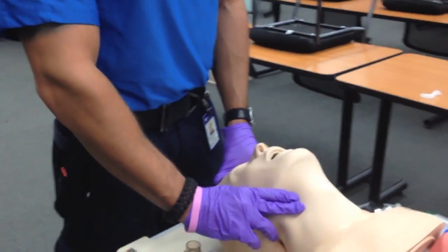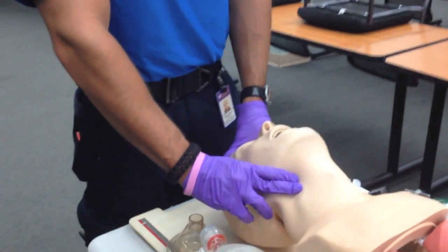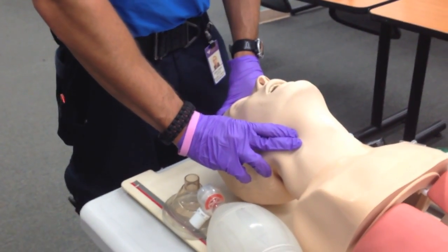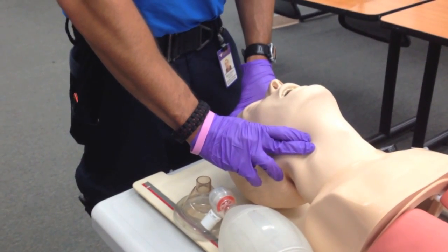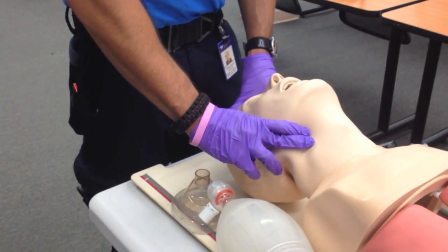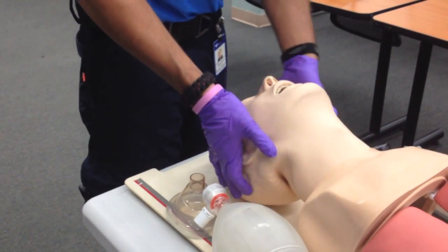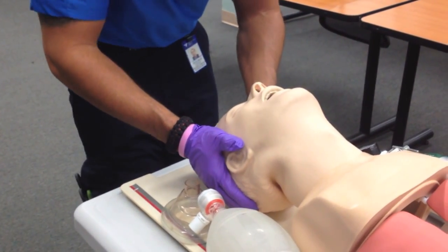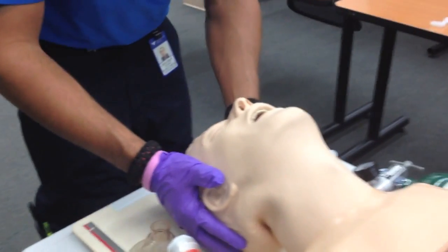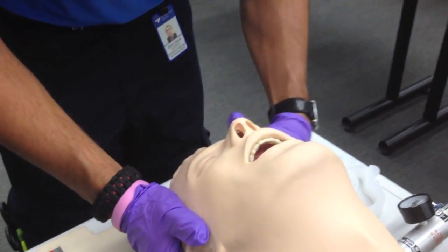I'm also going to check for a carotid pulse for five, no longer than ten seconds. A weak carotid pulse is palpated at a rate of 60. My patient is apneic, so I'm going to open the patient's airway using a head tilt chin lift and look inside the airway. The mouth is full of secretions and vomit.